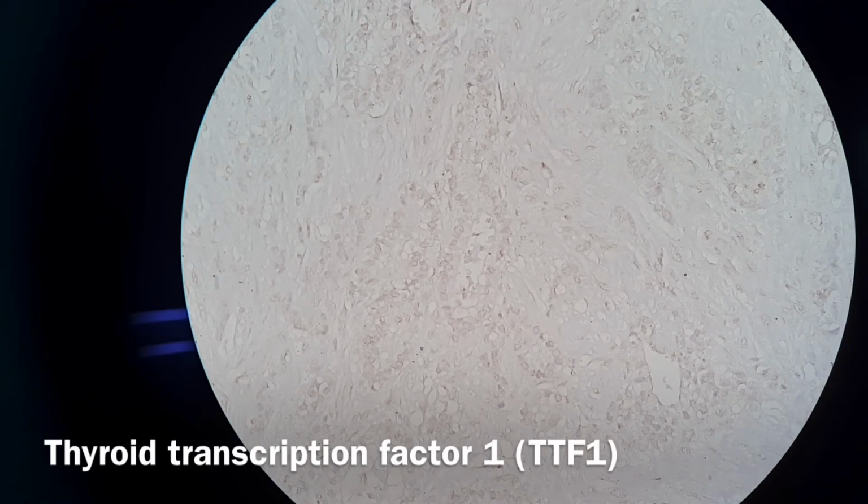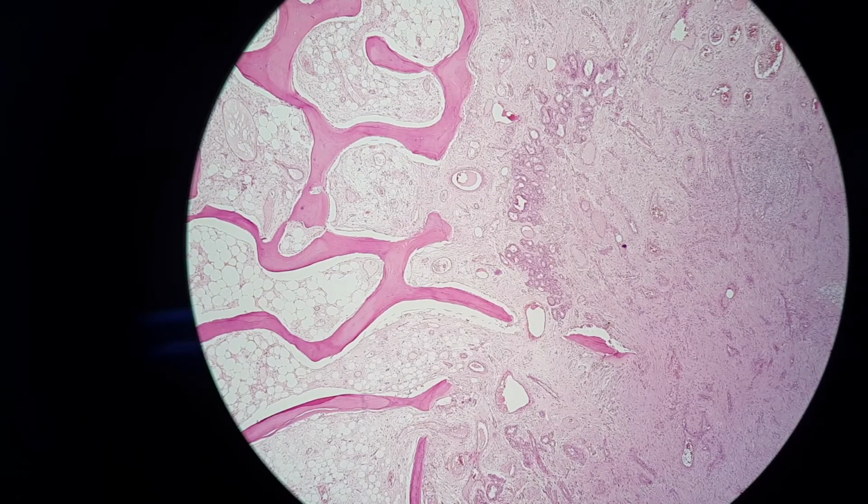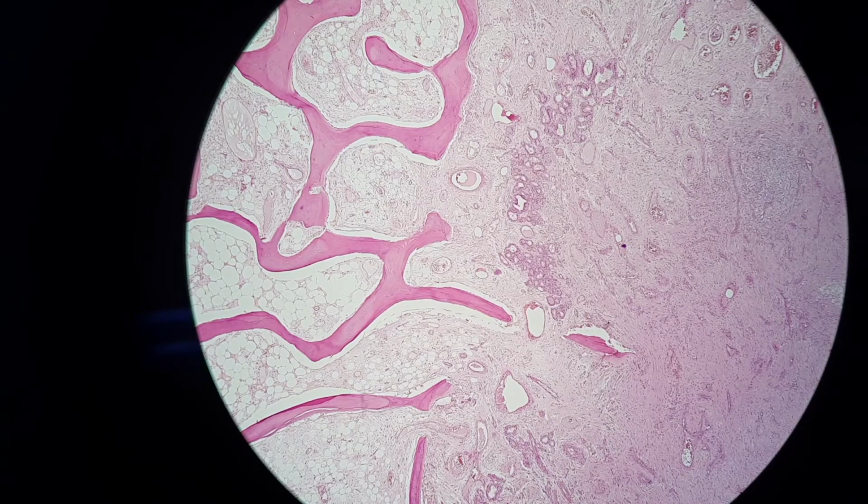However, you can see there is some faint staining of the nucleus in this case. So, to conclude, this case is a case of metastatic thyroid follicular carcinoma to the head of the femur, which caused a pathological fracture in this patient. So with that, thank you and have a nice day.